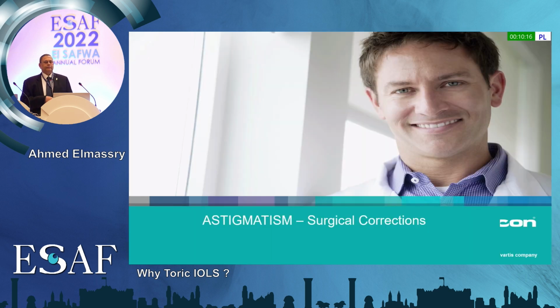And again, this is an important point when you are putting a toric IOL. Don't tell the patient he will be free from astigmatism. But our aim is to decrease the astigmatism to less than 1. 0.75 is acceptable, 0.5 is acceptable, because I'm telling the patient that the quality of vision differs with astigmatism less than 1. If it is more than 1, he is a little bit annoyed.